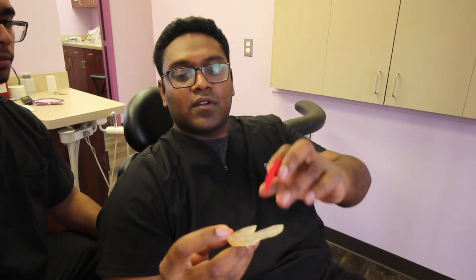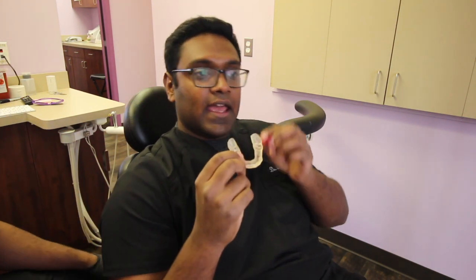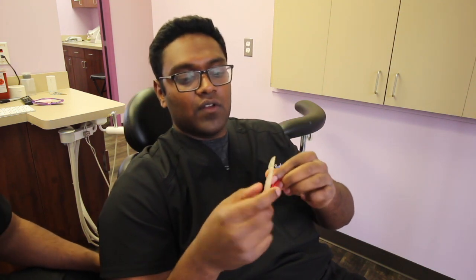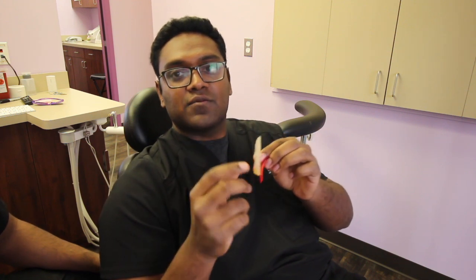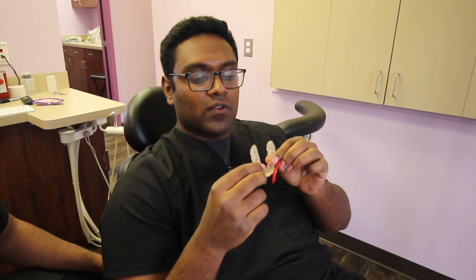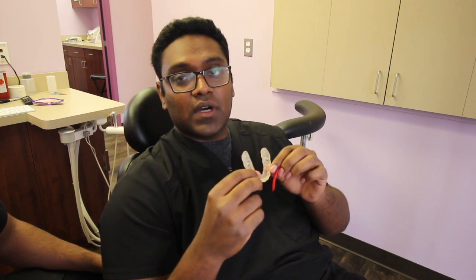So we have our splint 3D printed. We're going to try it in and adjust it. The first thing we're going to do is make sure it fits nice. Otherwise we adjust the inside. Okay, nice and stable. And then what we do is we use these little papers to make little marks on the teeth, okay? And it shows us where the teeth are biting. We want pretty much a triangle so it's seated, or as many dots as we can so it stabilizes the bite. And we'll make multiple adjustments, like today, then we'll do in 1 week, and then maybe another month, just to make sure everything's fitting right.